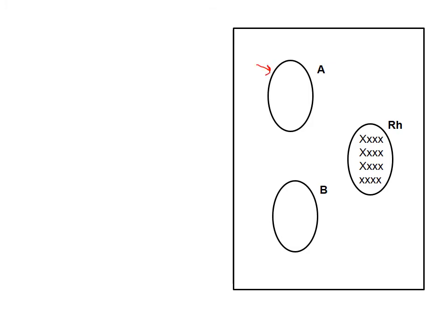Here's another one. No reaction here, no reaction here. We do have agglutination in the D or Rh portion. So this is now O positive.